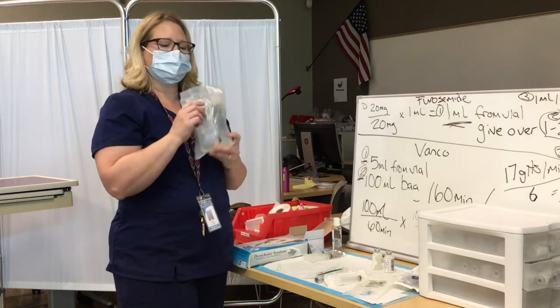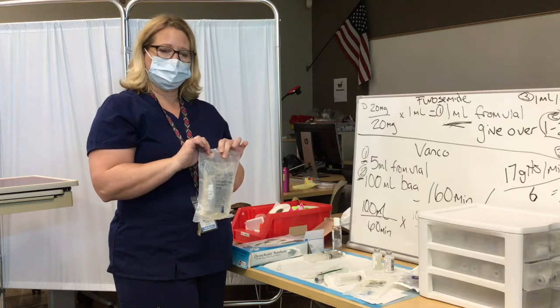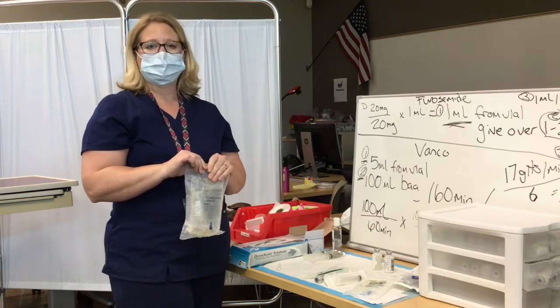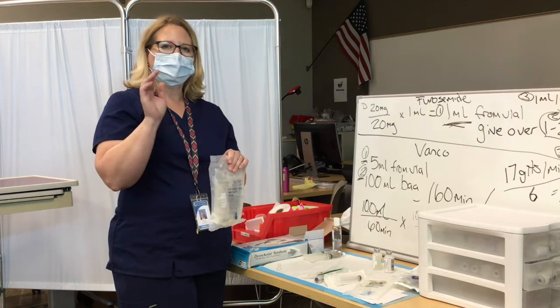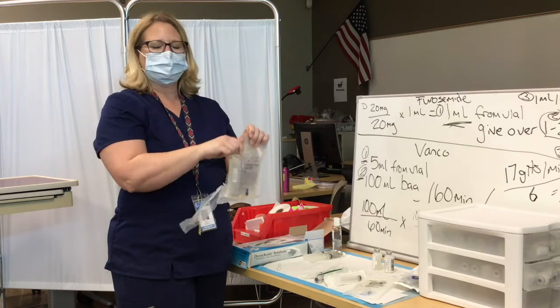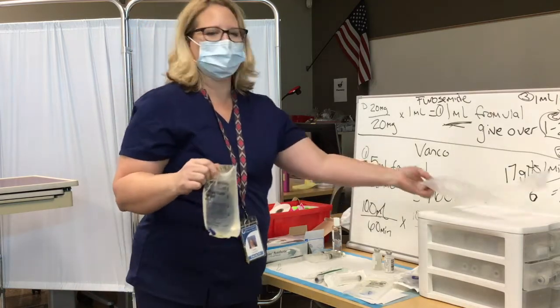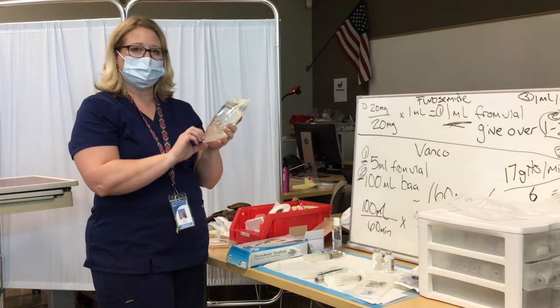You can see that we're also going to need, if you look at your list, a primary IV line, not for the IV push, but for the secondary. All of our secondaries, we run with a primary line. And when you come into practice, I will demo to you why we have to put a primary line up with our secondary.